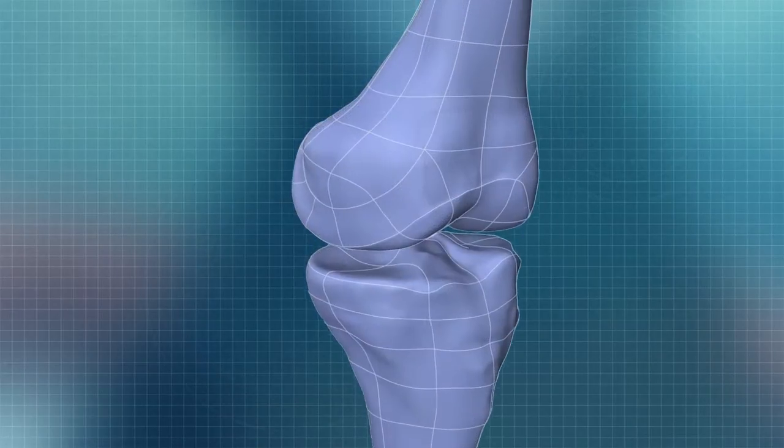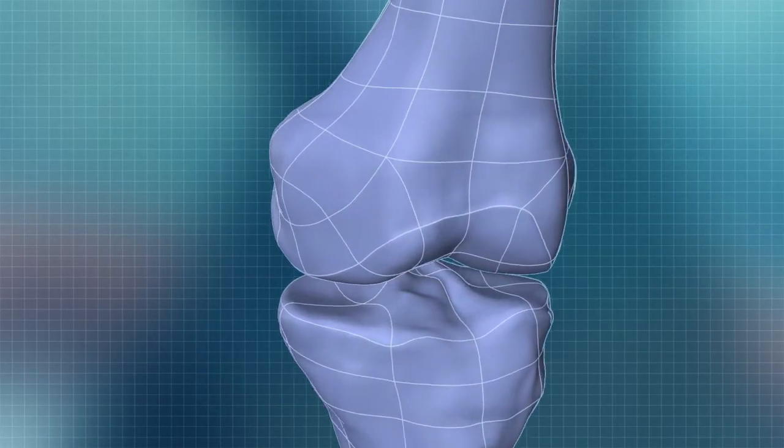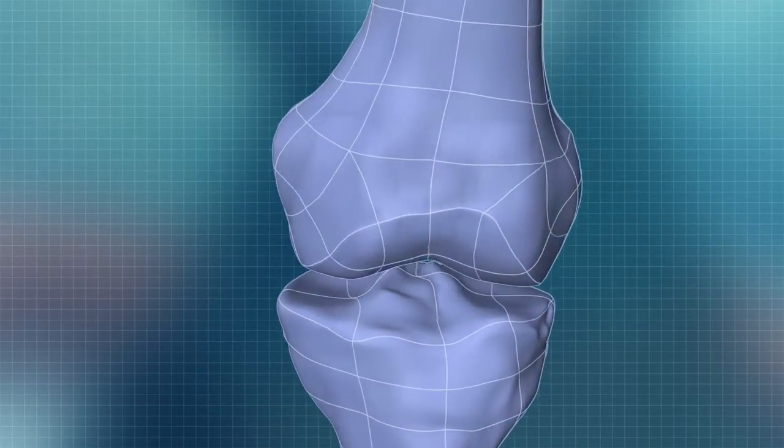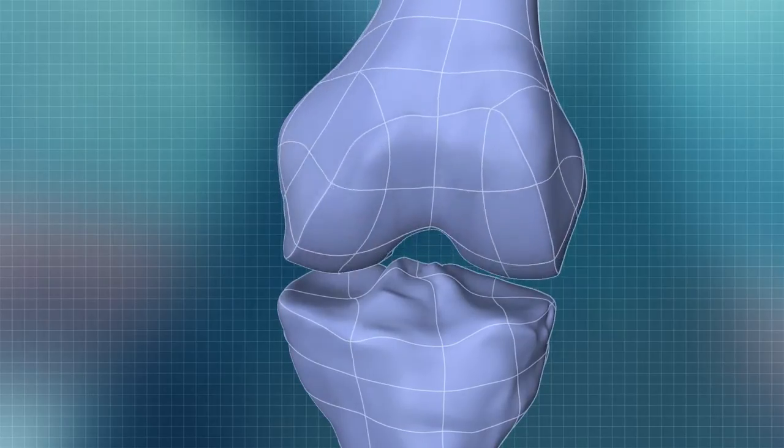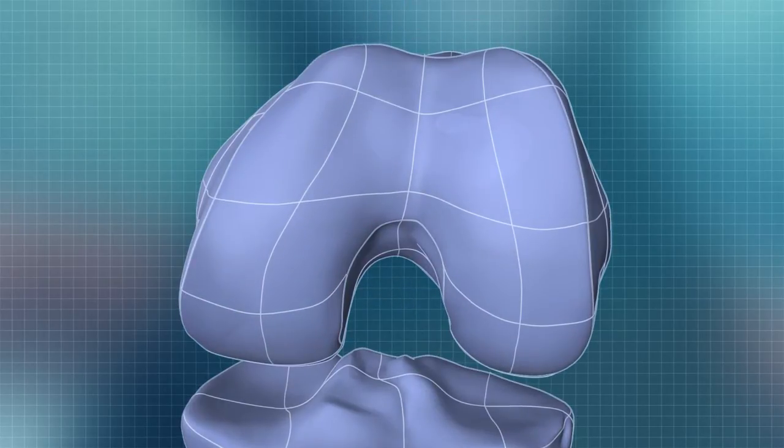In the 3D environment, iFit recreates the patient's natural J-curves, corrected for deformity.